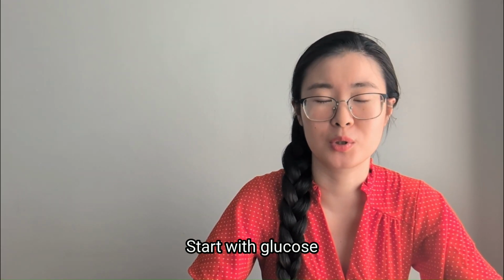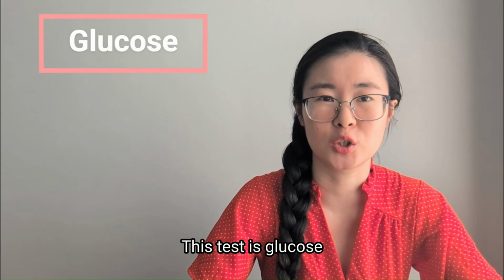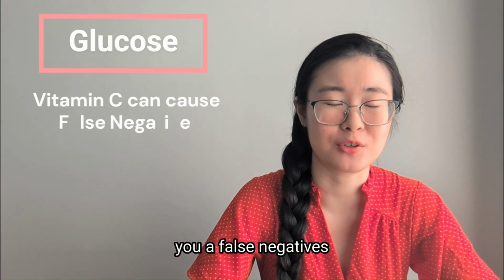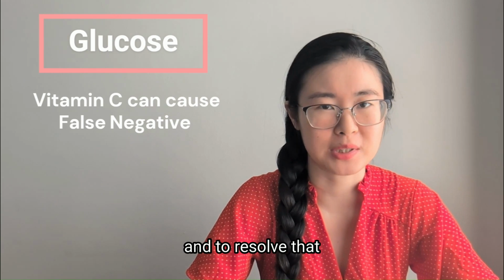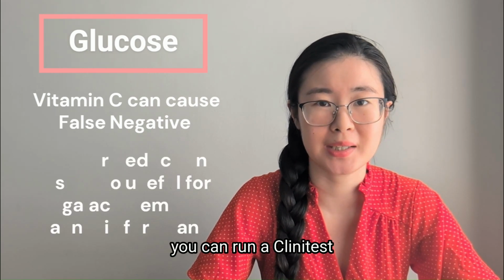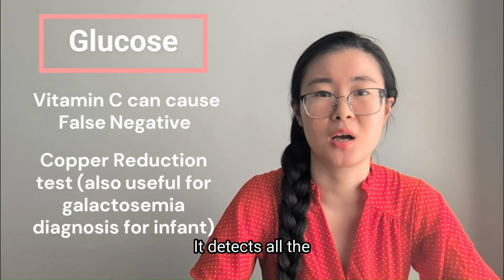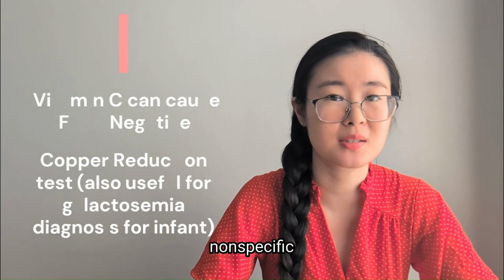Start with glucose. This test is glucose specific. For this test, vitamin C can give you a false negative. And to resolve that, you can run a clinitest, which is a copper reduction test. It detects all the reducing sugars, non-specific.